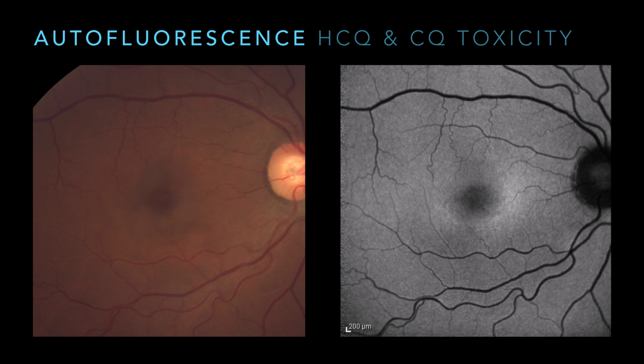Patients can have other retinal diseases that show up so differently on OCT as compared with chloroquine or hydroxychloroquine toxicity that I'll say, I'm okay with you staying on this drug because I know you're fill in the blank. Diabetic retinopathy doesn't look anything like this. And so again, it's the specificity. Again, bullseye maculopathy, there's a lot of things that can cause it. I don't want to say it's too specific, but it is very sensitive for chloroquine toxicity.